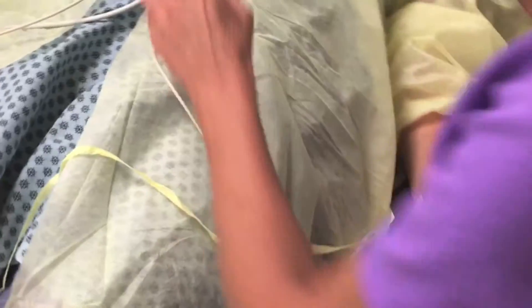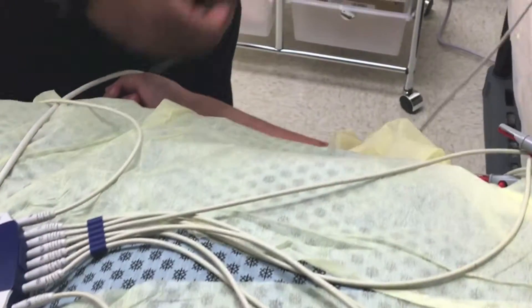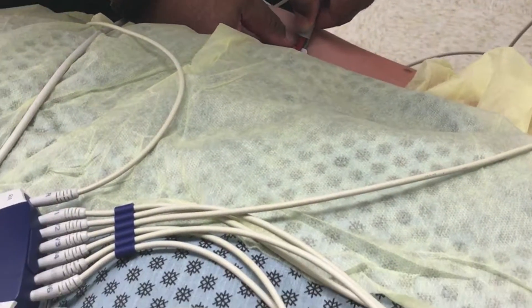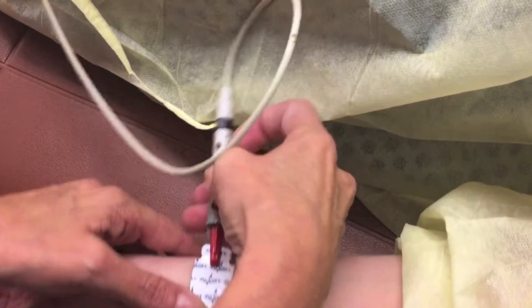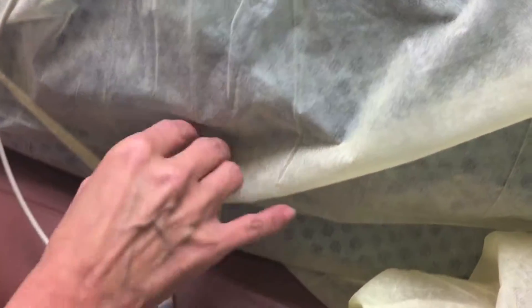This is going to be right wrist and left wrist. So this is the RA — this goes on the right wrist. And this goes on the left wrist.